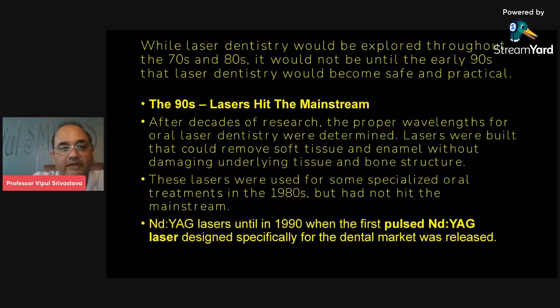Lasers were built that could remove soft tissues and enamel without damaging the underlying tissues and bone structure. These lasers were used for some specialized oral treatment in the 1980s, but had not hit the mainstream. Nd:YAG was the first laser approved to be used in dentistry. It was a pulsed Nd:YAG laser. Nd:YAG lasers are still used in dentistry. So this is a soft tissue laser. I will talk more about the detail.